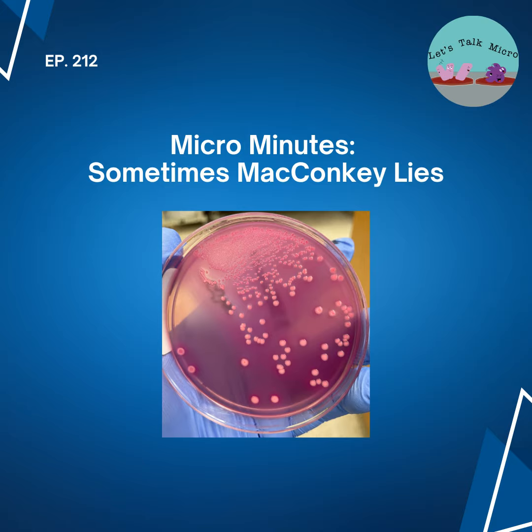However, there are some fastidious gram-negative rods that do not grow on MacConkey. They have growth requirements that MacConkey does not provide. Examples, as I mentioned earlier, are Haemophilus, Pasteurella, and Eikenella. These organisms are not going to grow on MacConkey. So therefore, if you're thinking, as in myth number 1, that if it doesn't grow on Mac, it is not a gram-negative rod, that is incorrect.